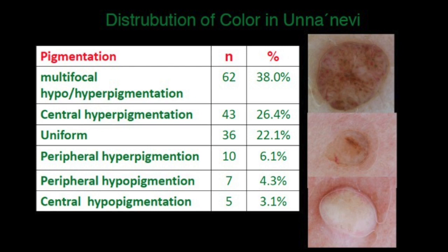What do you see on dermoscopy? So in terms of color, brown. So you'll often see brown color. The brown color can be distributed in globules, but also just present in skin, but not in a structure. So if you look at the middle image, notice that there's brown pigment, right? But it's not in a structure. It's not like in a part of a network or a globule. It's kind of just pigment that's present on the skin. And you'll see why that's important in a minute. And then sometimes they can be fairly hypopigmented, but there's nothing else there, just hypopigmentation.